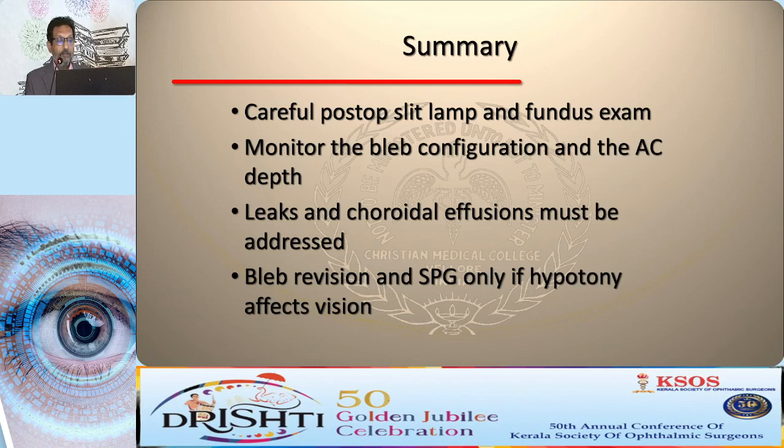So the summary of this is that a careful post-op slit lamp examination, monitor the bleb configuration, leaks and choroidal effusions must be addressed, and you do a bleb revision or patch graft only if the hypotony affects vision.